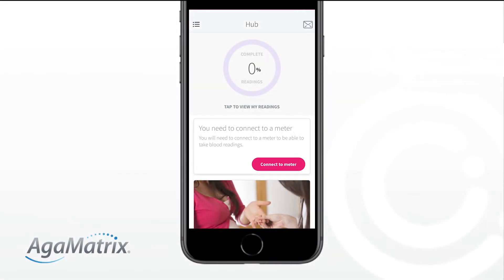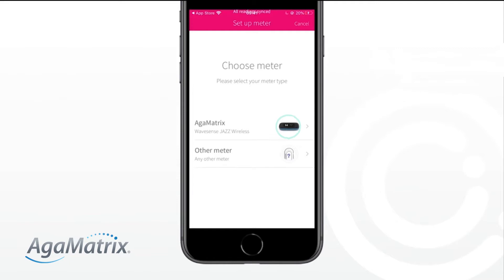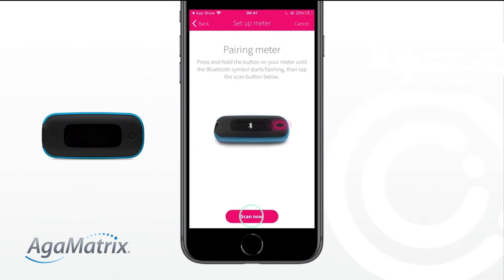Next, you need to connect to a meter, also known as pairing. Choose the AgaMatrix WaveSense Jazz wireless meter. Next, tap the Scan Now button and press and hold the button on your meter so that a flashing Bluetooth symbol appears.